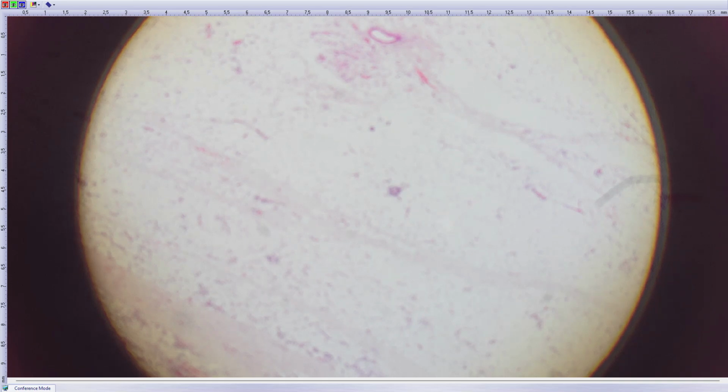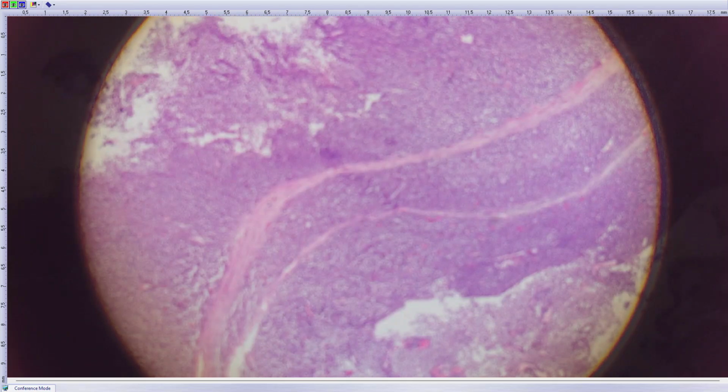So this actually, I would say in soft tissue pathology, the most important tumor not to miss is undifferentiated melanoma, because it's one of the most common high-grade malignancies we see in soft tissue. And if you call it undifferentiated pleomorphic sarcoma and you don't take action to diagnose melanoma, you will basically not allow the patient to be treated with these modern drugs.